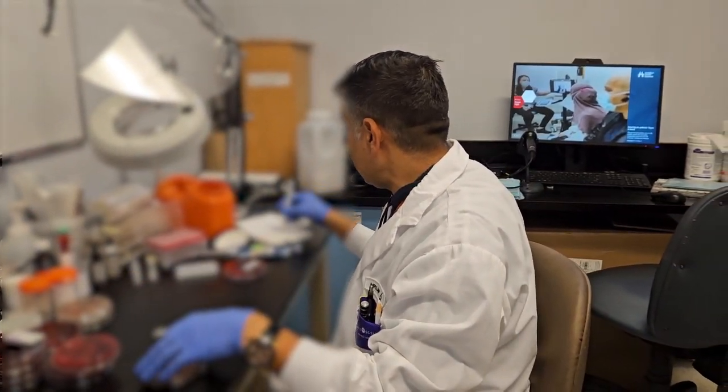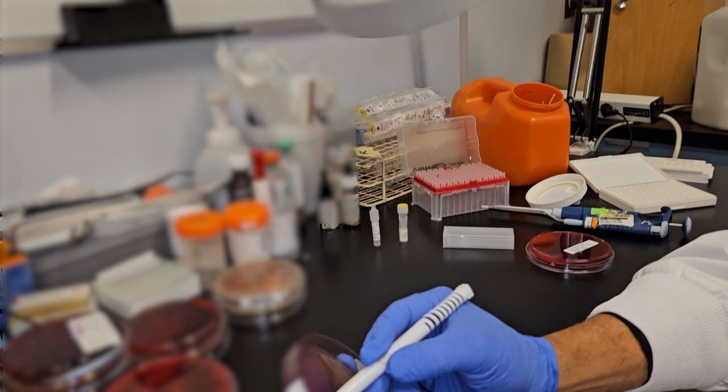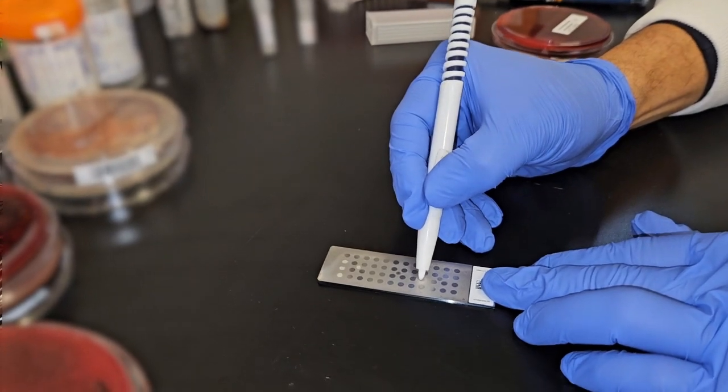Let me do the second one as well. I'm going to repeat the same process over again, trying to take a representative colony from 3 to 5 isolated colonies and make a thin spot on the target slide.